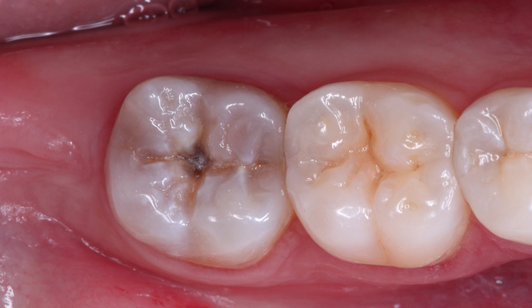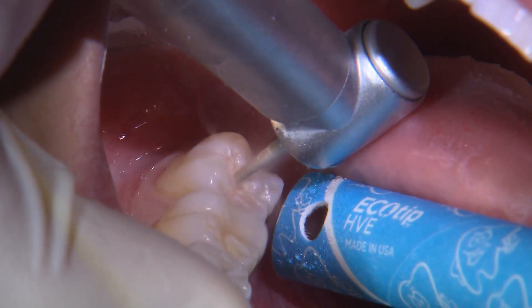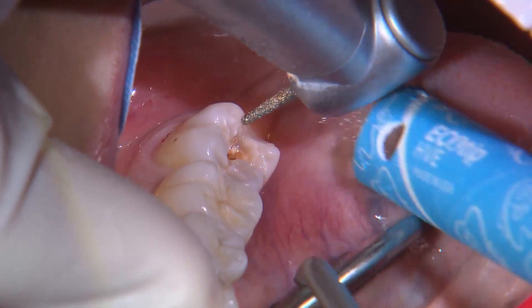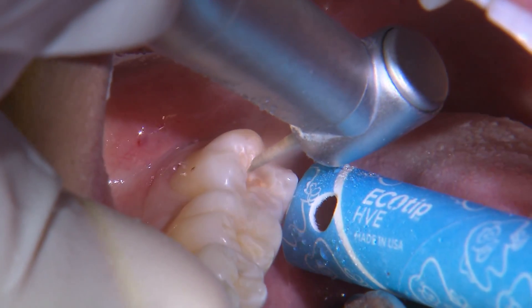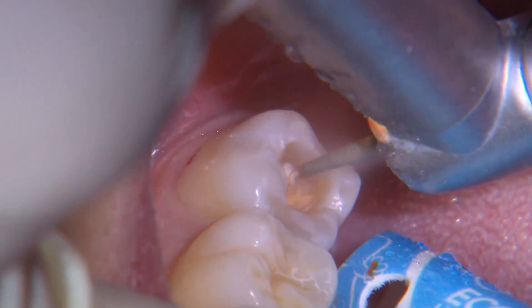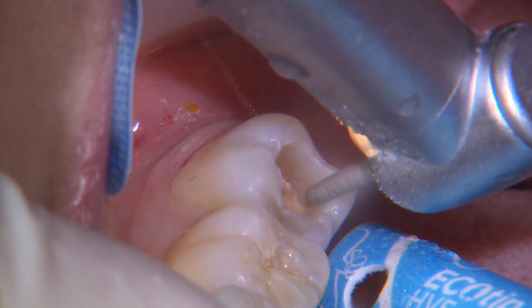The objective for any caries removal is to first identify the extent of the decay. Here, I'm using a medium grit round end tapered diamond to extend the preparation in all directions until I locate uninfected DEJ. You are able to use any gross reduction burr of your choice. Because I'm focused on the DEJ initially, I only let the burr extend to a depth of about 2 millimeters.